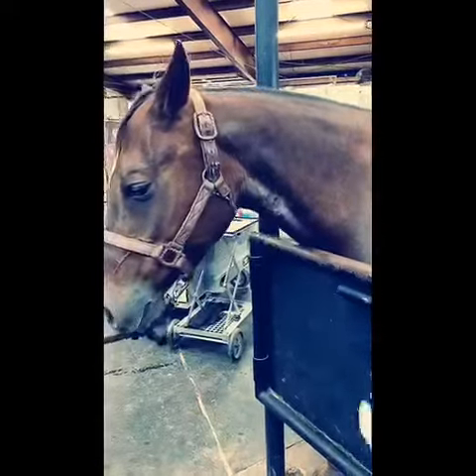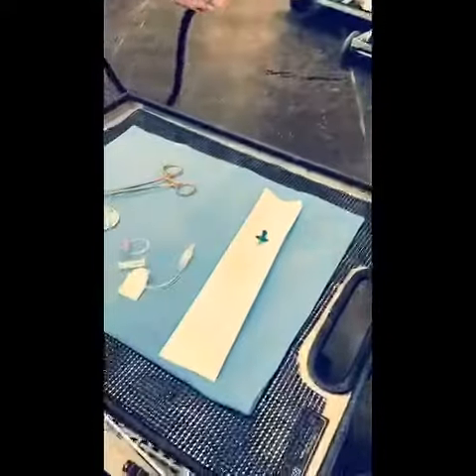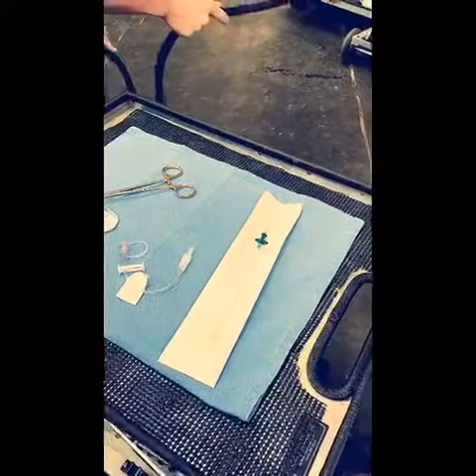As you can see, I've aseptically prepped and clipped our jugular furrow. I flushed my multi-use extended catheter and my micro-bore extension set.